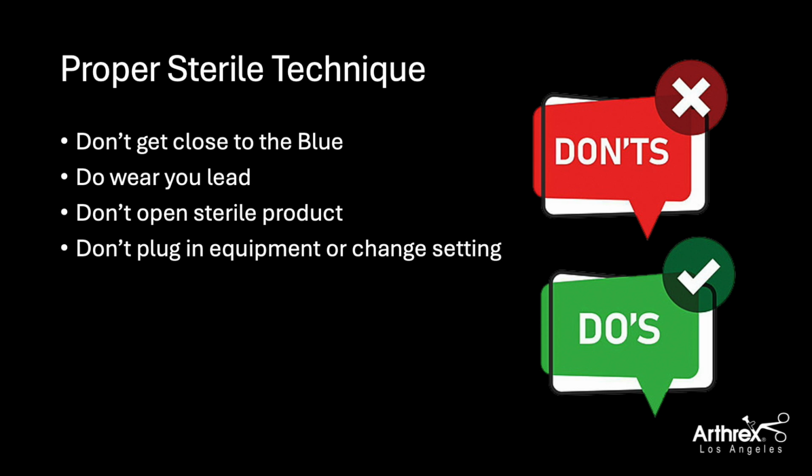The other thing too is the safety aspect. You want to make sure in these spine endoscopy cases, they will be taking some shots with x-ray, so make sure you have lead on. Again, this is something that is really important for your own safety, and also within the case support.